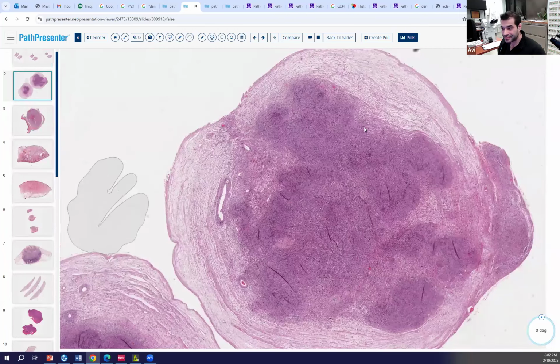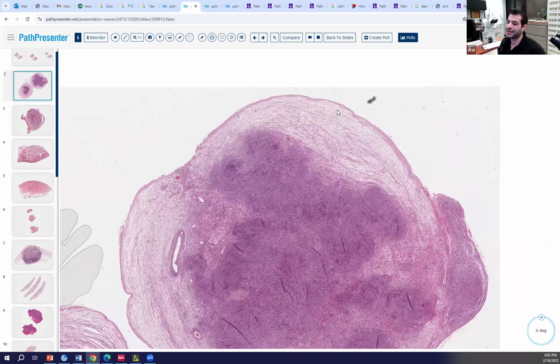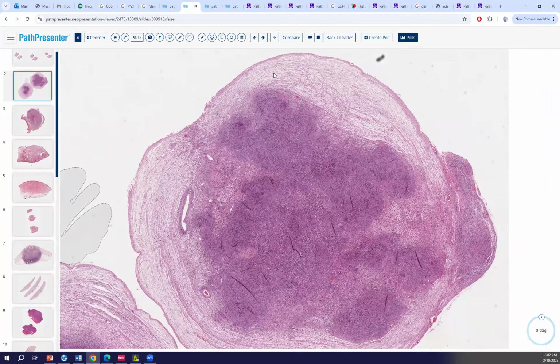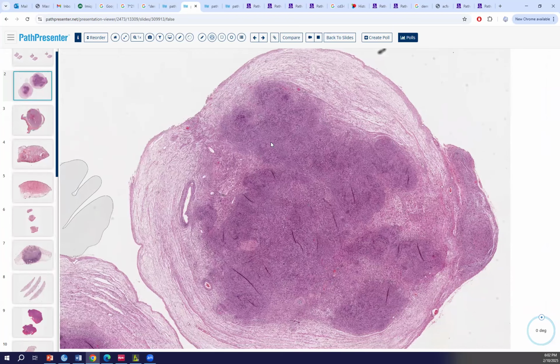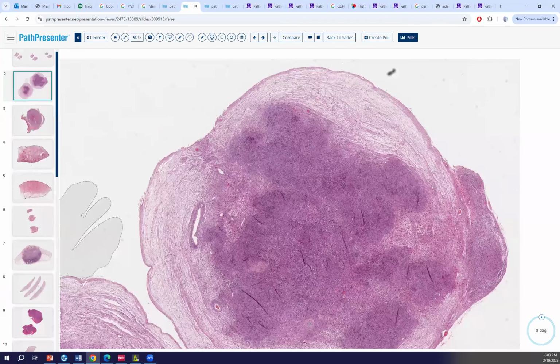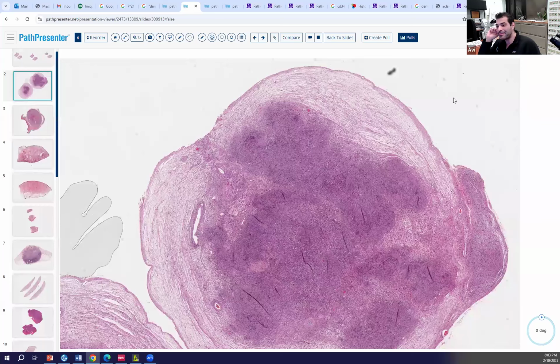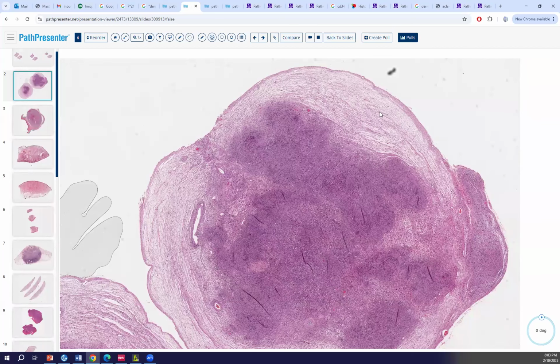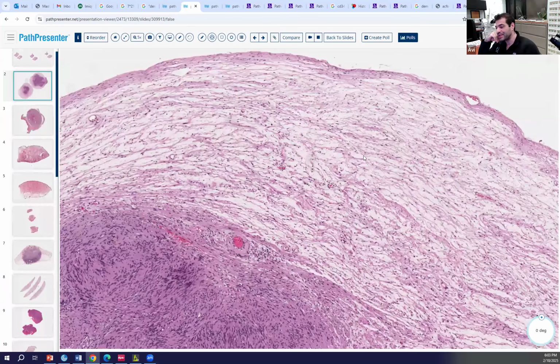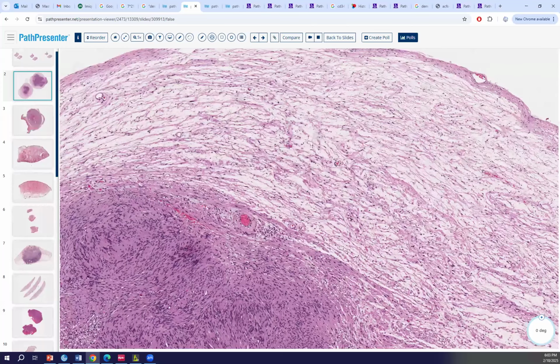What do you see here? It's a schwannoma. Yep. How are you getting there? Because you have the Antoni A and B tissue. The B is like that whitish tissue around, and the A is the alternating dark. Then you have a capsule, subcapsular edema, and some people may say that the Antoni B may represent the subcapsular edema.